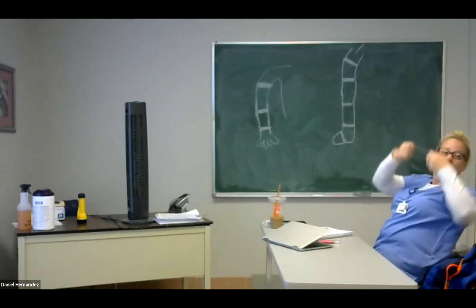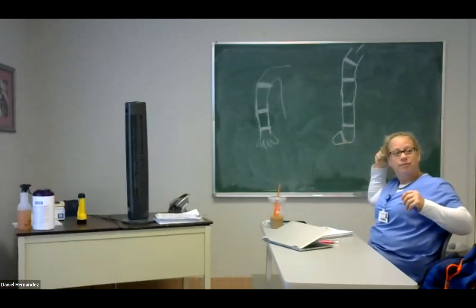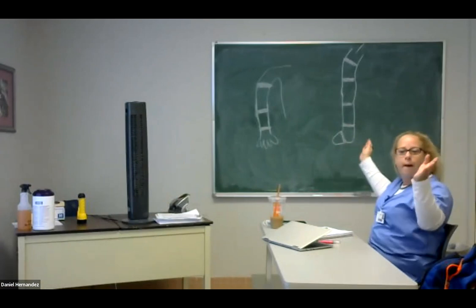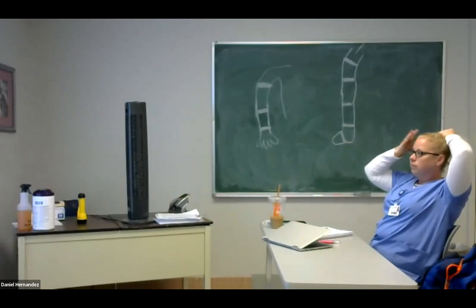We did the test, we did it. The numbers are what the numbers are. Your waveforms are what the waveforms are, if you've done your steps. Picture, freeze it, and you're on your way. If you're thinking this doesn't make sense, you recuff, you redo it, and you're getting the same exact thing, it is what it is.